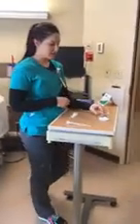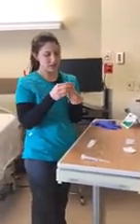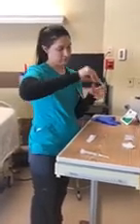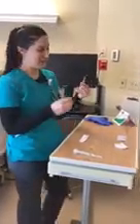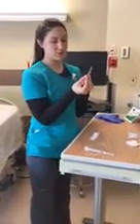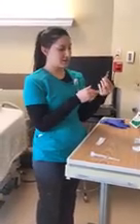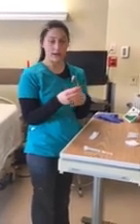I'm going to go ahead and go to the dispensary and remove my Lovenox. So I do see that there is an air bubble in that Lovenox, so I'm just going to go ahead and shake that out. It's not coming out very good. Perfect. Okay. In addition to that, it is the right medication. It is the Lovenox. It is the correct dosage. There are no particulates, and the glass is intact. There is no broken, and it is a single dose vial, so I will be throwing it away after we use it.